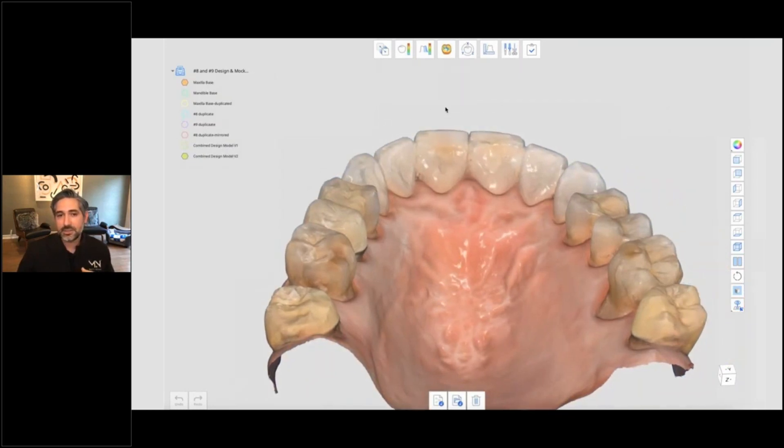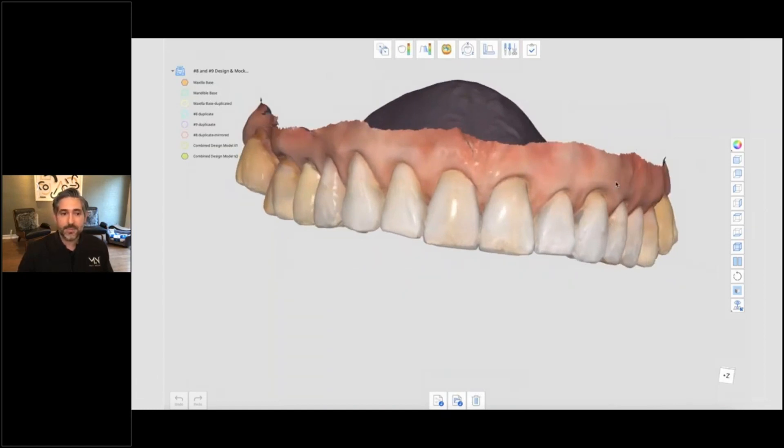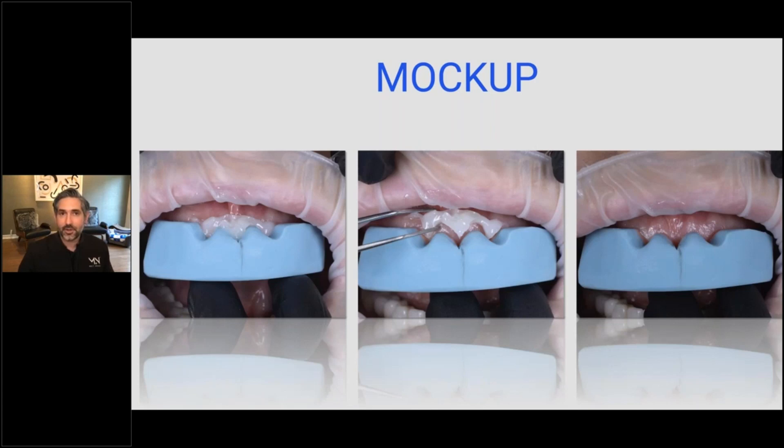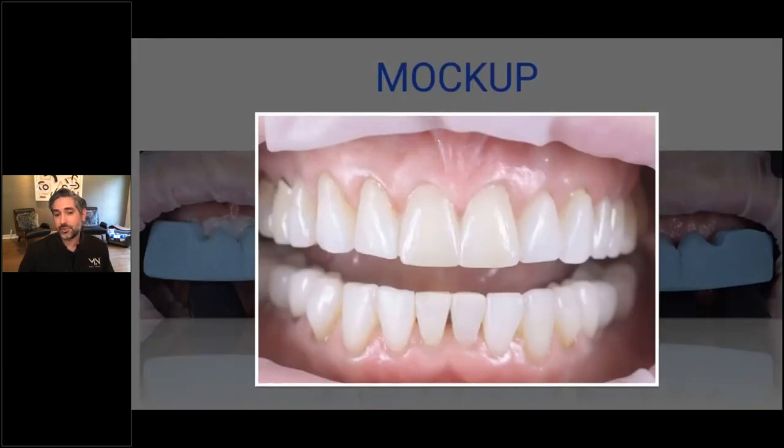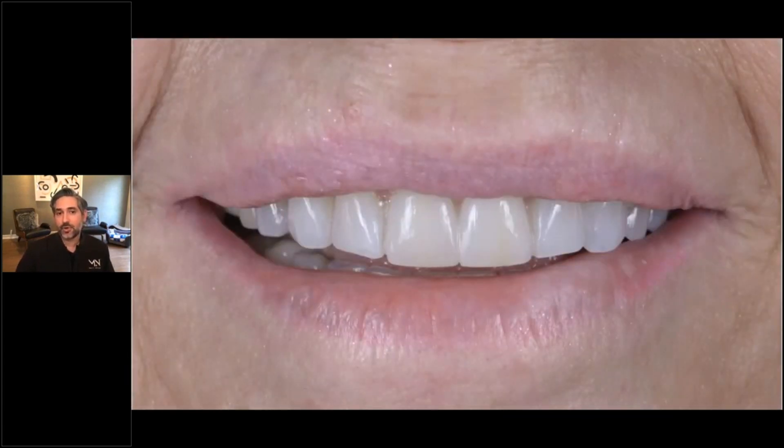Even better is to see it in the mouth with a mock-up procedure. So I 3D printed the model and did a mock-up — I have a silicone putty made from that printed model. I used Vasalis PMMA in the bleach light shade to compensate for that yellowish tint. You wait till it hardens up and remove the excess. This is a no-prep mock-up, just to evaluate and get her approval on the shape. This was actually the second mock-up — the first one was a little bit too long, so we went just a hair shorter. She really liked it and gave her approval, and now we're going to use that for our final design.